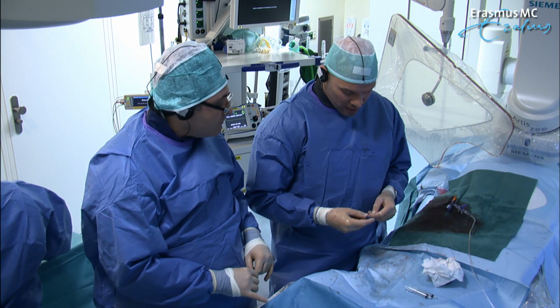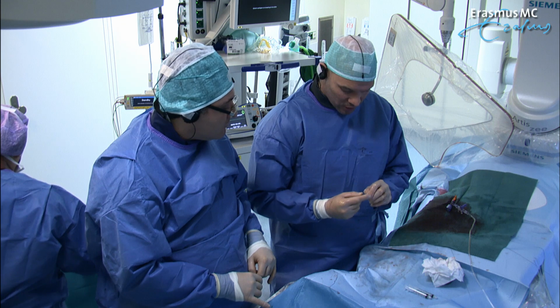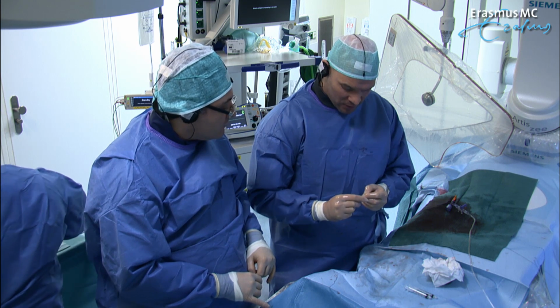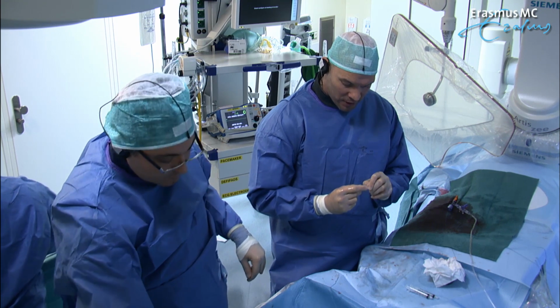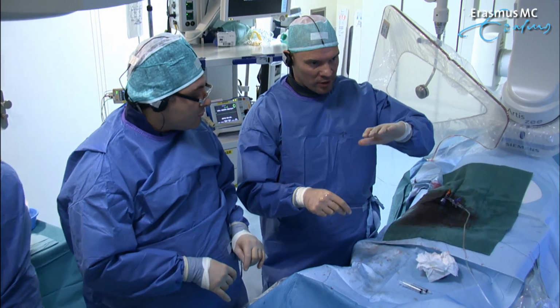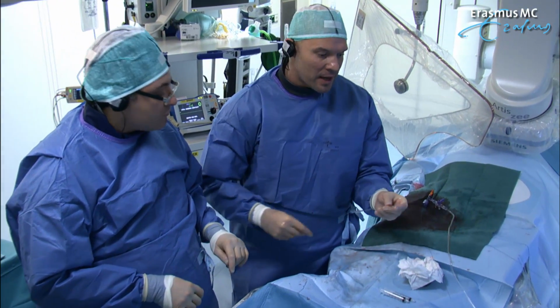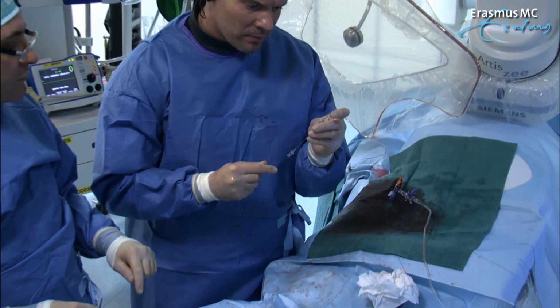I think it's always better to do the assessment without additional contrast in your system, because it will always affect the zeroing of your pressure, and the pressure sensing is less accurate when there is contrast exposure.